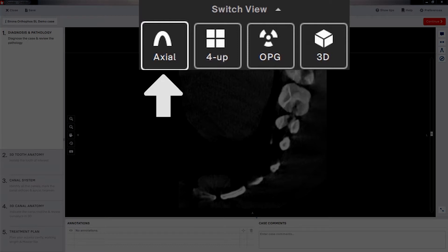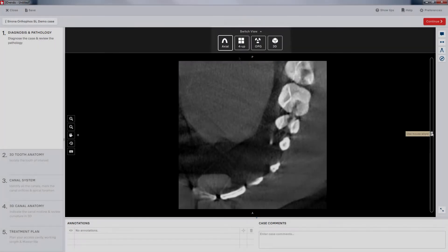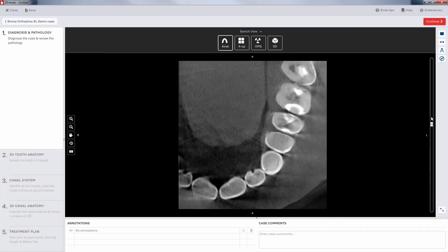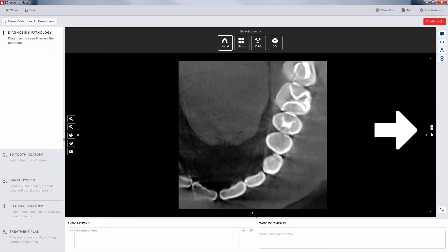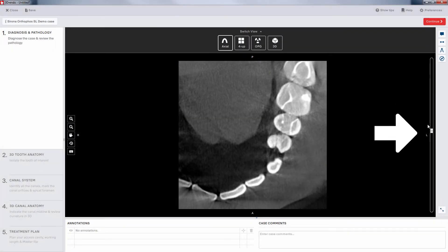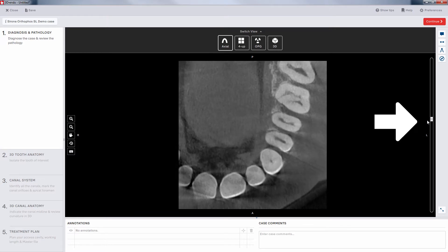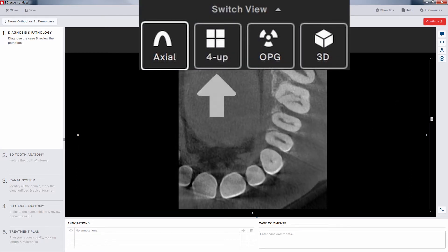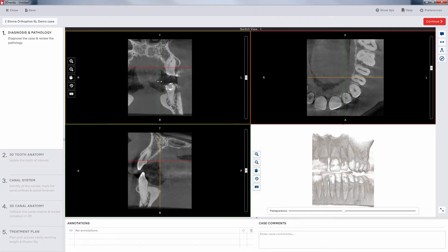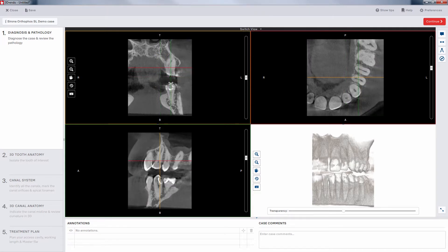The first icon indicates an axial view. Use your middle mouse button or the slider on the right side of the section to scroll through the slices. The next icon opens a more traditional multi-screen view. Each of these windows is clickable, and any adjustment in one will be reflected in the others.